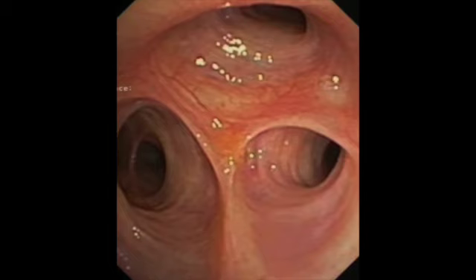If we were wanting to isolate the left lung, then we would want to clamp the bronchial lumen. If we were wanting to isolate the right lung, we'll clamp the tracheal lumen. Because in this patient's case, he's having a left lung procedure, we want to isolate the bronchial lumen, or the left lung. In order to do so, we will clamp the bronchial lumen and open up the bronchial port.